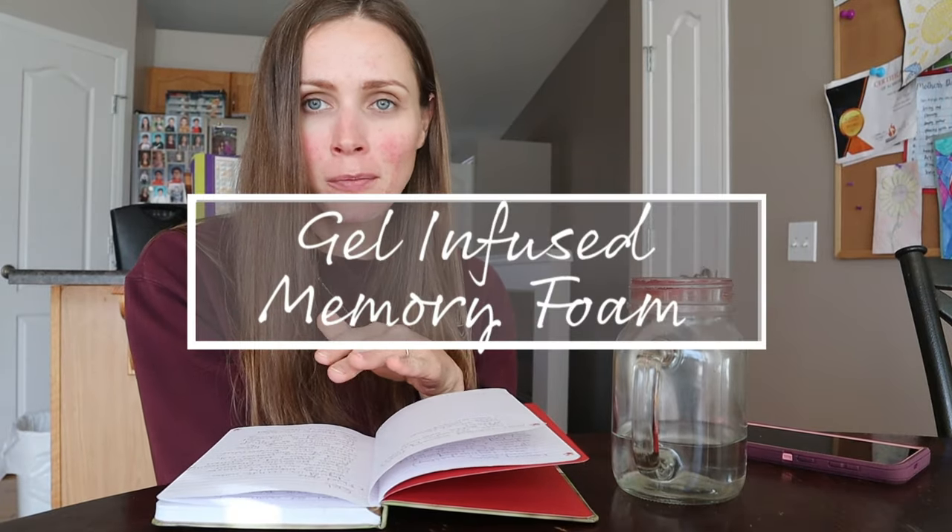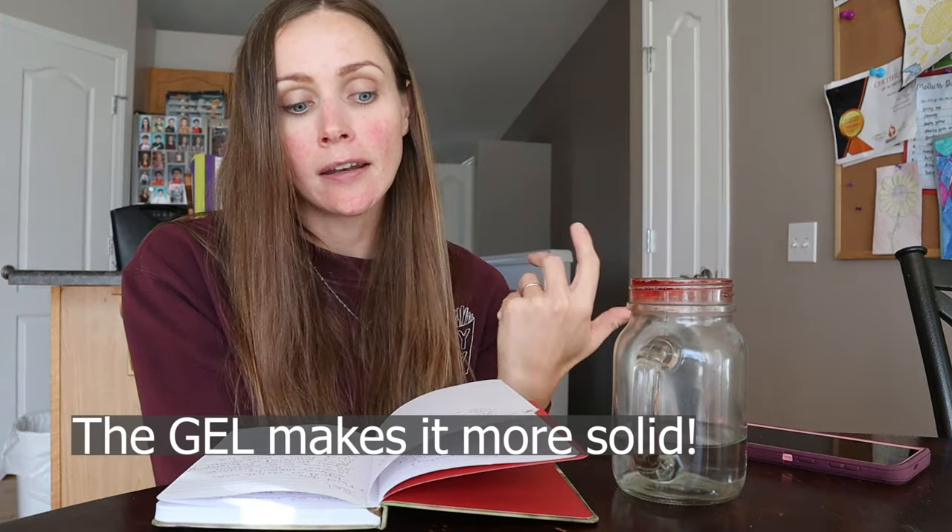One more type of foam is gel infused memory foam — a hybrid between gel and foam, where gel molecules are mixed in with the foam. It is more resilient and bouncier than traditional memory foam. It is more cooling because the gel acts as a cooling agent. It has more structure because the foam makes it more solid. It is heavier because gel is a heavier medium than foam, so if having a light cushion is important to you, that's a factor. It is more responsive — it returns to its shape faster — and has more support and structure than traditional foam or memory foam.